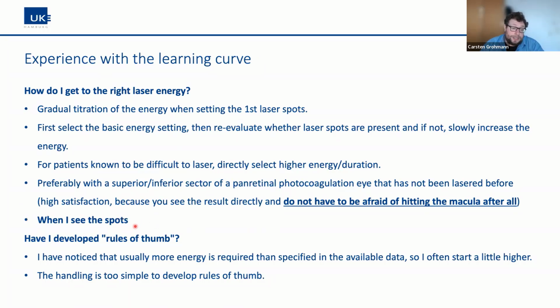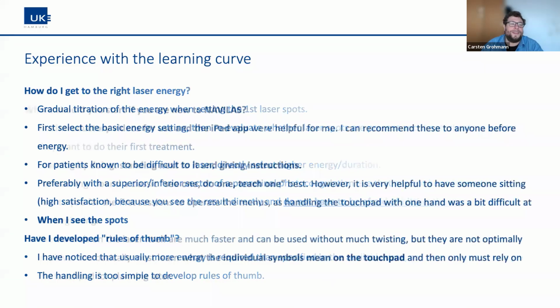When I see the spots, okay. Have I developed rules of thumb? I have noticed that usually more energy is required than specified in the available data, so I often start a little higher. Sure. Handling is too simple to develop rules of thumb. Okay, that's a good opinion over here from a colleague of mine.